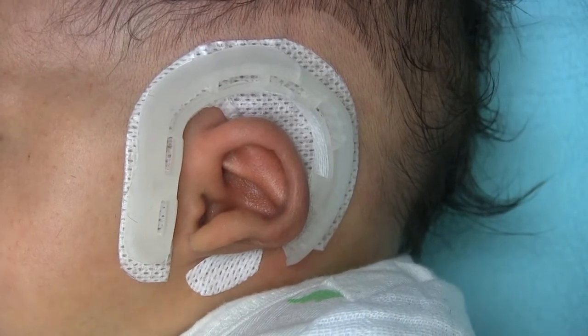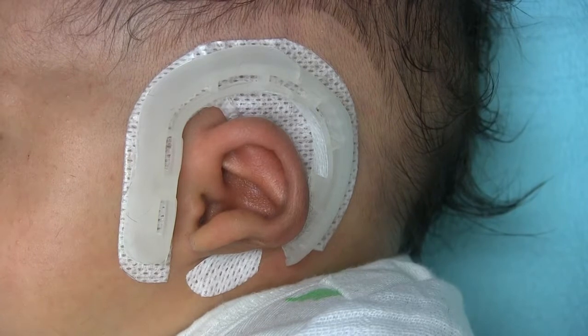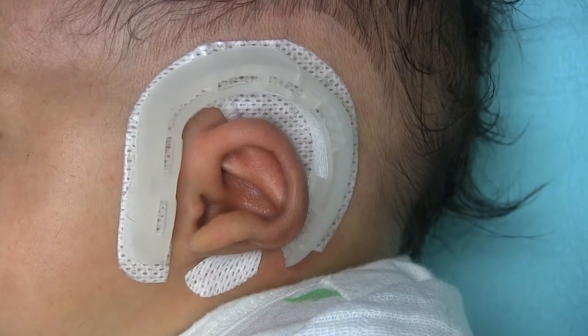Get on? Mm-hmm. Okay. Let's try mixing this. We've got plenty for you here.